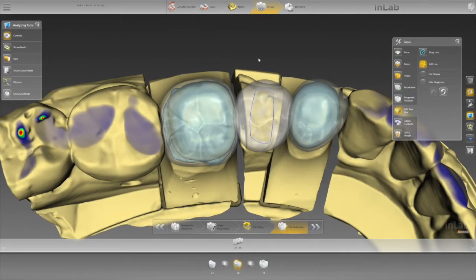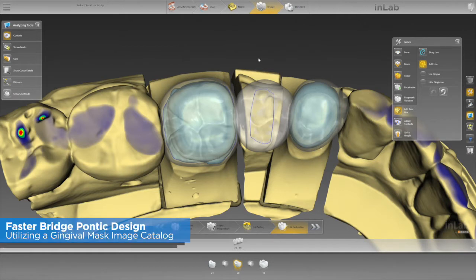Hello everyone, welcome to Tech in 2. This is Michael Smith. Today we're going to look at pontic bases.